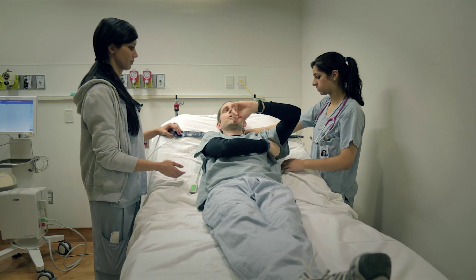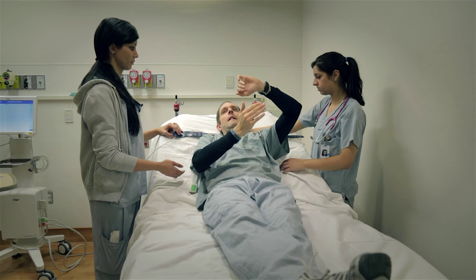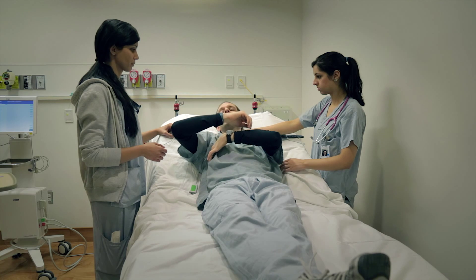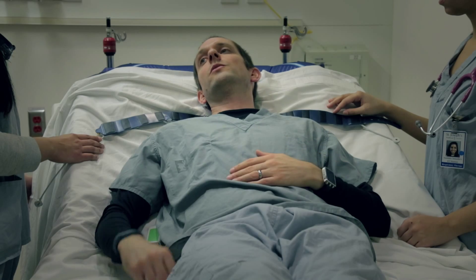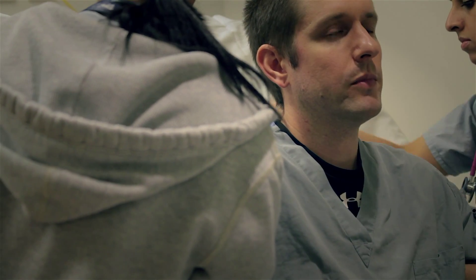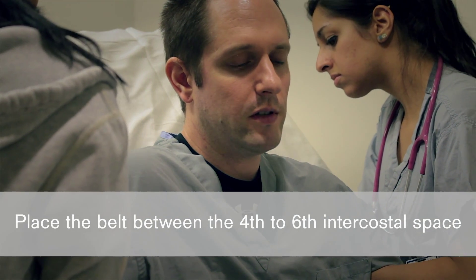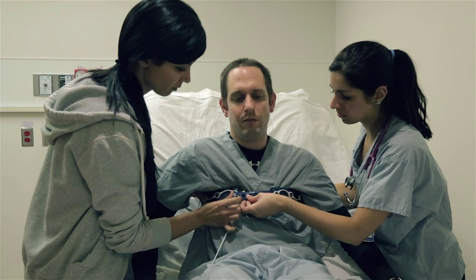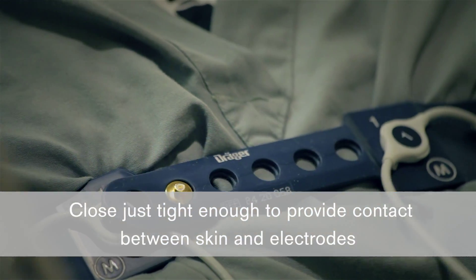In terms of how low you're going, visually guide about one to two inches below the armpit — you have to eyeball it a bit. Pull your area to one to two inches below the armpit. When you pull that across, hold it firm, then follow up by pulling your end firm. To prevent the patient's head from falling back when you lift, bring the head of the bed up a bit. Pull it up, pull it down, then on the right side pull that around and under the armpit, one to two inches under. The contact just has to be there — it doesn't have to be tight, as long as the contacts are touching the skin.